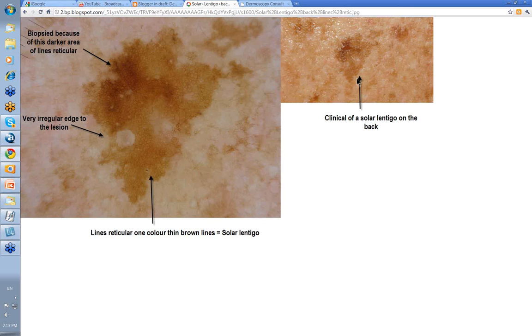This lesion here was on a person's back. Note the irregular edge, a little bit more pigmented in this area, with a background of pigmentation. When you look with a dermatoscope, it's basically lines reticular — see the irregular edge. It was biopsied because of this darker area. You could argue though that it's lines reticular, so it's one pattern, one color with thin brown lines. And when this was examined histologically, it was just solar lentigo.